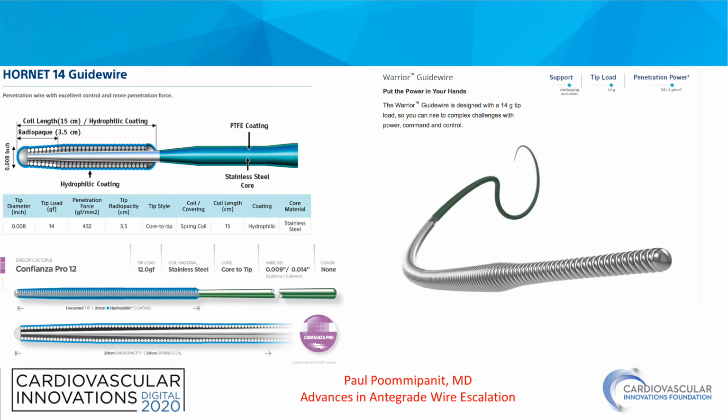This fourth category of wires is what I consider the penetration wires. These are typically tapered tip, hydrophilic, non-jacketed wires. Tip loads range anywhere between 10 and 20 grams. These are typically used to cross proximal and distal caps.